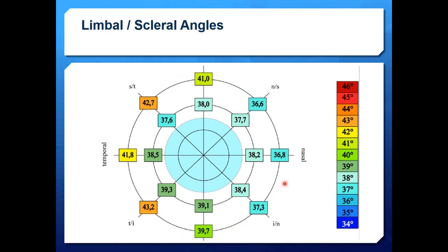So that indicates to us that if we're dealing with scleral lenses that land closer to 15 millimeters, then we should be able to get away with symmetrical, non-toric scleral lenses. If we go out larger toward the 20 millimeter chord, then we may need more asymmetrical surfaces because the eye, the sclera, is more asymmetrical out there.